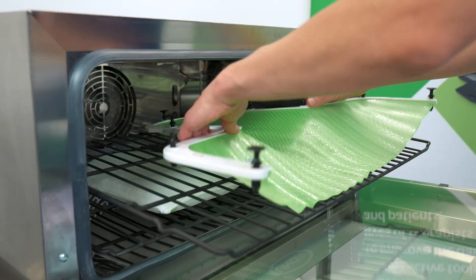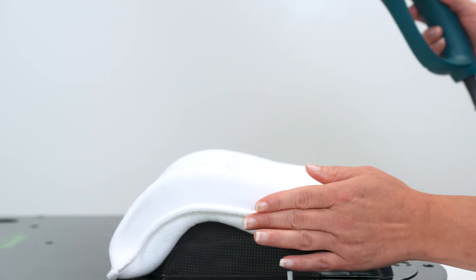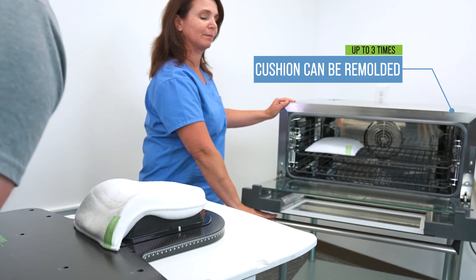One of the best features of the Clarity Cushion is that it's remoldable. The cushion is one per patient of course, but you can spot treat it with a hairdryer or heat gun, or completely remold it by placing it back in the oven.